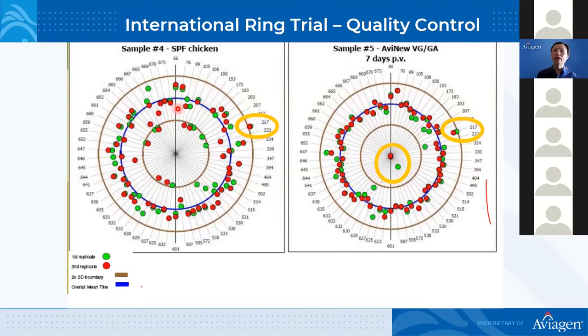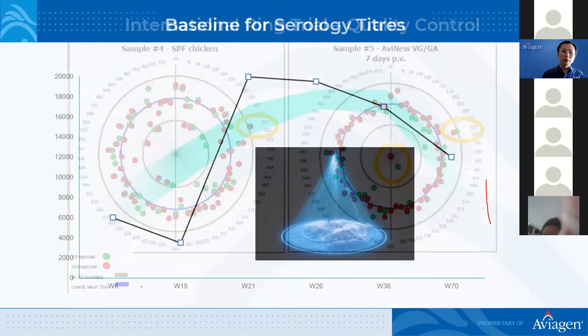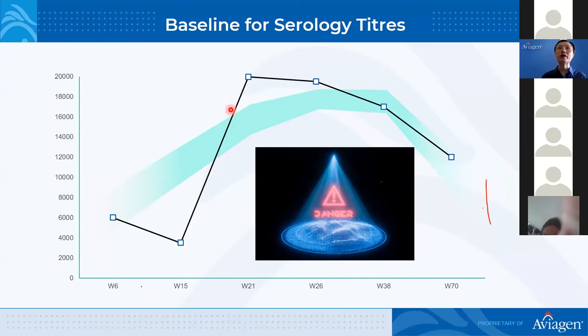Okay, you cannot have one test kit for SPF chickens testing high titer in a certain country. Okay, this is unacceptable. So we cannot put enough stress on the word baseline. You can see even before this meeting started, I found a video of BioChek explaining all the contents of my talk. Okay, they're talking about baseline, comparing the abnormal to the normal. Okay, this is a very important pre-alarming system, could be so-called proactive and also active. Okay, so we need to utilize the data.